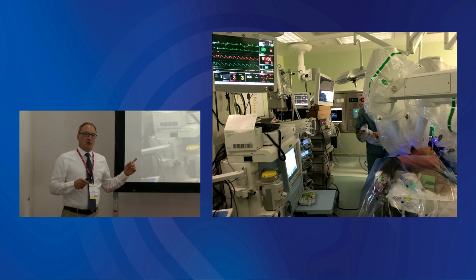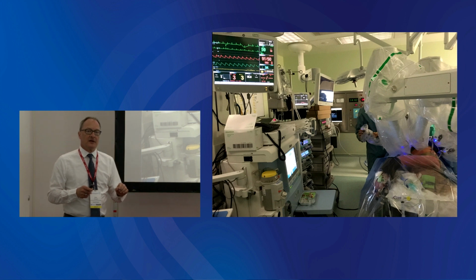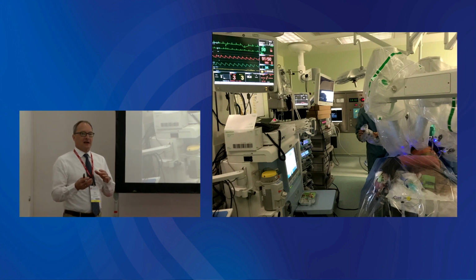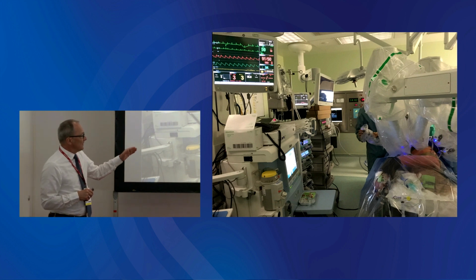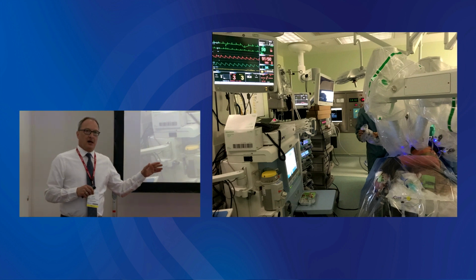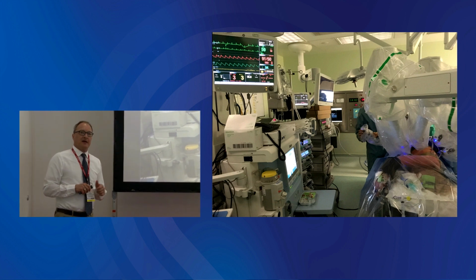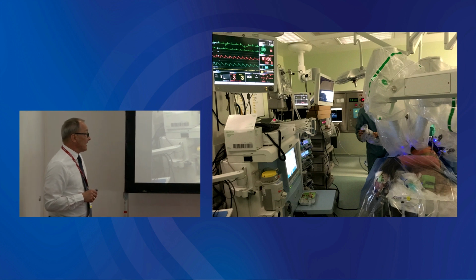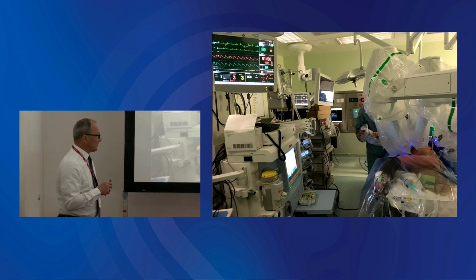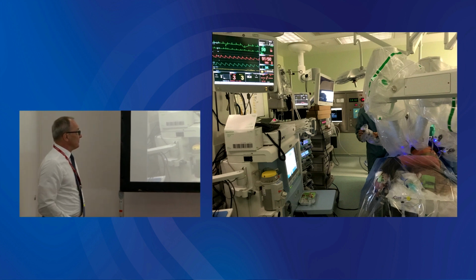Remember, one of the qualities being detected is movement, or movement acceleration, and quite often the arms are a bit subjected to inadequate movement, and therefore we were looking at which is the best. So we found out that actually the arm on the dependent side is less affected by these artifacts.